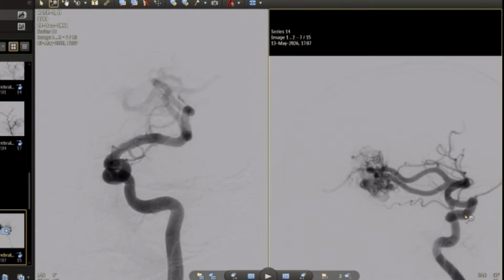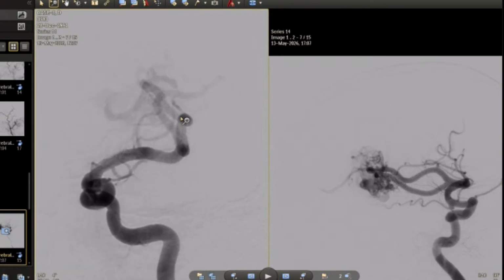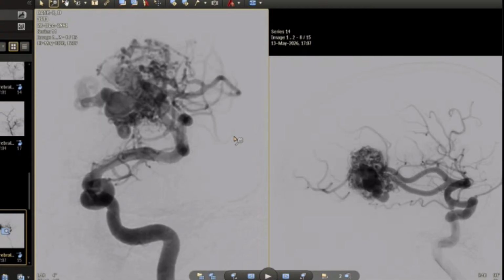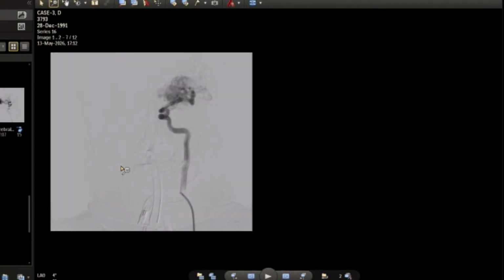Yes, it might be choroidal aneurysm, and all this part is basal ganglia. It's deep-seated AVM. This part is also going there. The strategy for today is a partial embolization. Because of the lack of the instrument, we will try to do it as safe as possible.